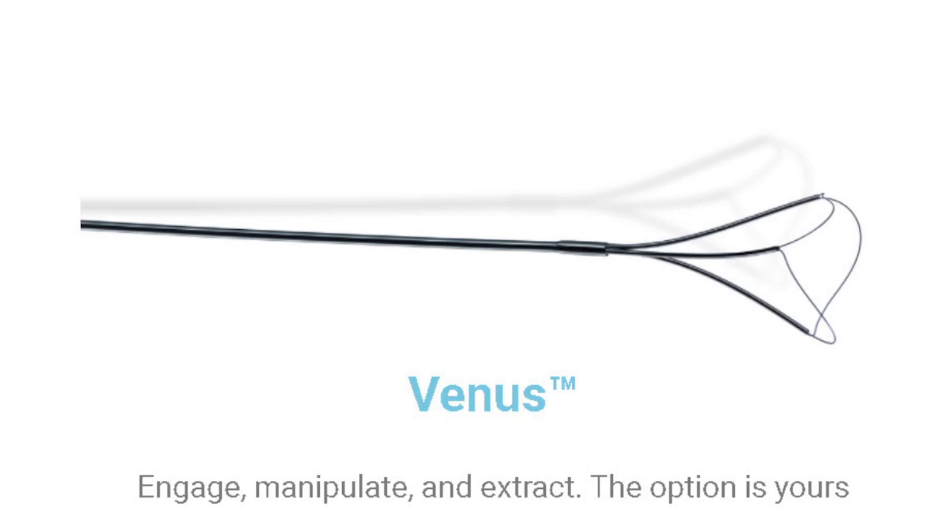The Venus comes in different sizes. I like to use the smaller one — the one that opens pretty small — because if I use one with a large opening and grab the stone, I'm still going to need to fragment it before I can bring it down the ureter. So I always pick the smallest one, with the smallest opening, so that I'm least traumatic and I'm able to capture a stone I can easily bring down through the access sheath and down the ureter.